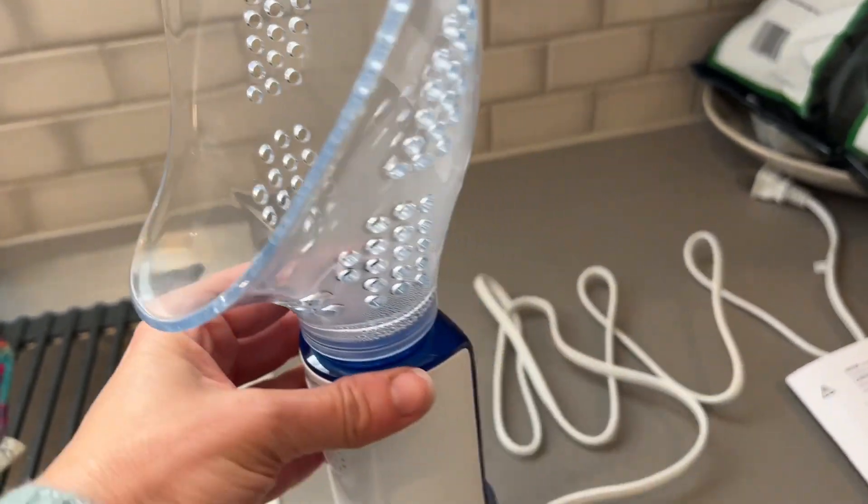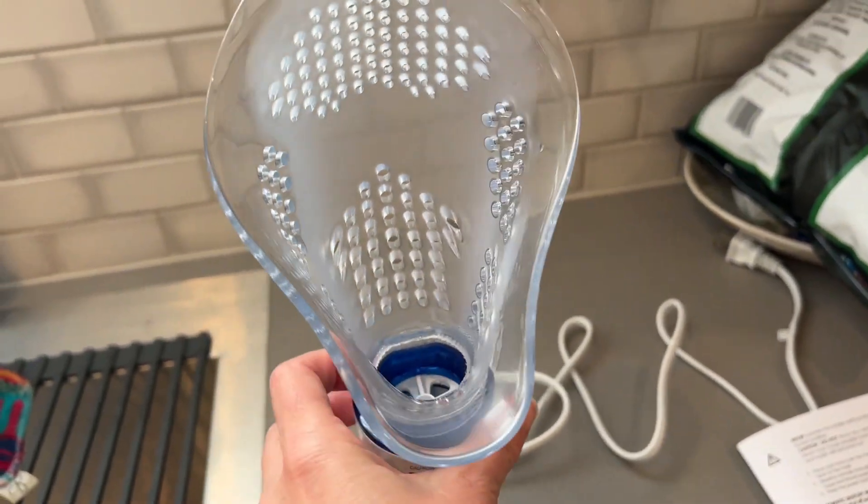I'm going to try this. It's a very strong menthol scent — it's going to clear up your sinuses right away. I can't really keep my face in this for very long. It says that you can put two vapor pads in this, but I think that would make me pass out.